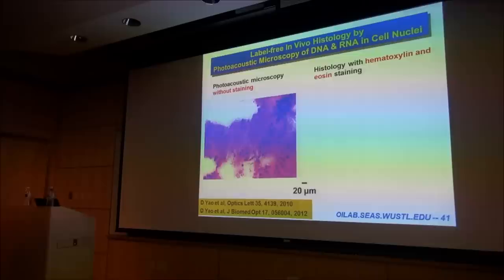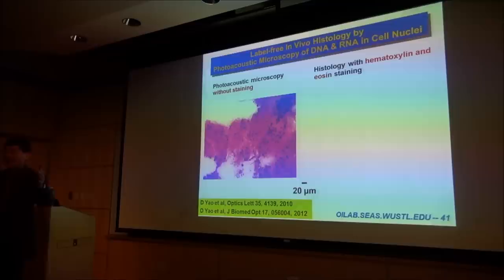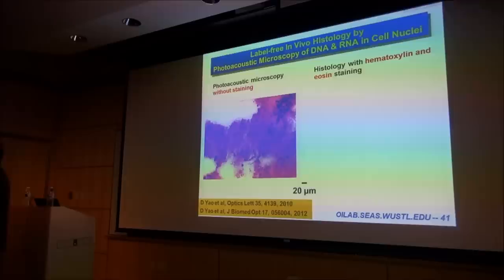Now I mentioned histology. As we talked about a little bit before, with standard histology, you have to cut the tissue up. But that's a gold standard. Between radiology and pathology, these are the two important eyes of any physician. But radiology is non-invasive, while pathology is terribly invasive and takes a long time as well. So can we bring histology or pathology to in vivo?